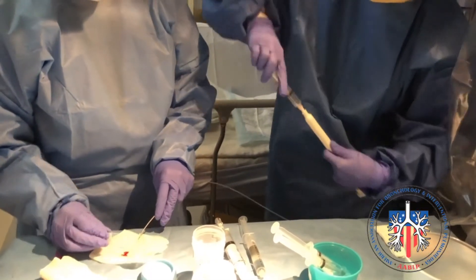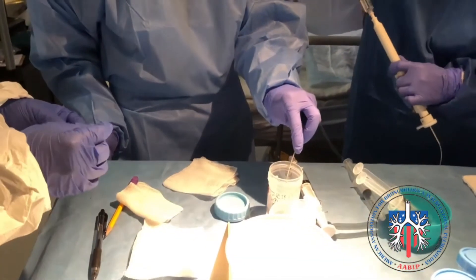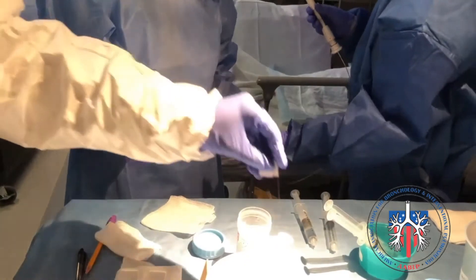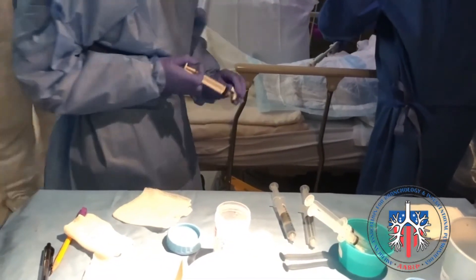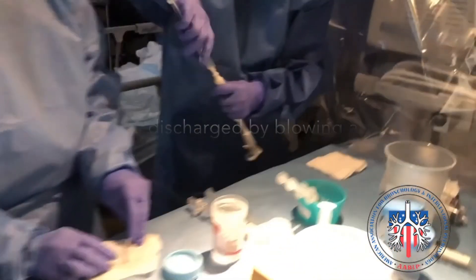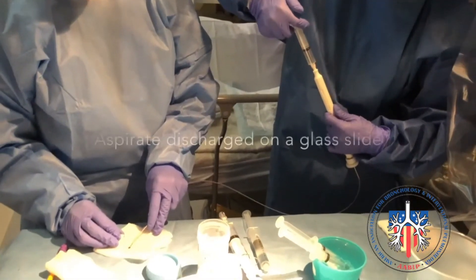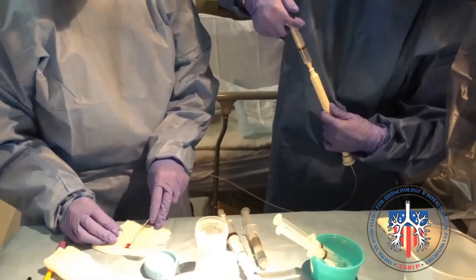Here we have a quick short clip on how to prepare a slide from an eBus TBNA aspirate. This is the slow motion of the clip. The first step is to attach an empty syringe with air to the top of the needle, while the other assistant holds the needle tip to avoid splattering of the material and to make sure the aspirate is discharged onto the glass slide.